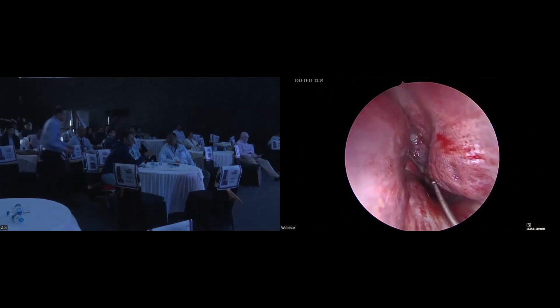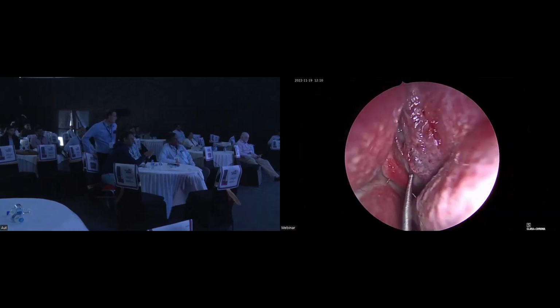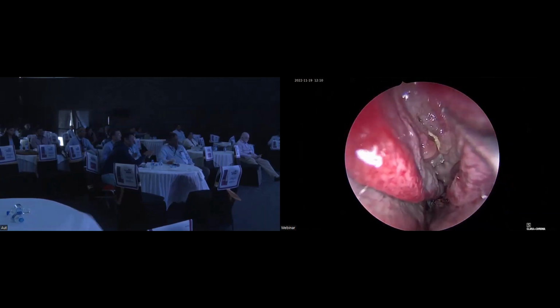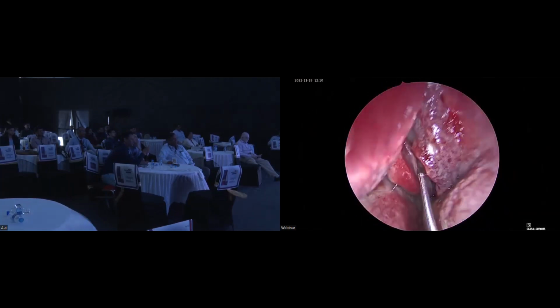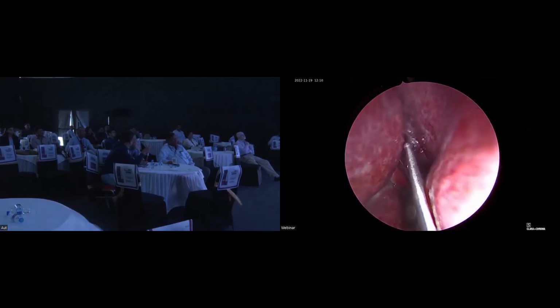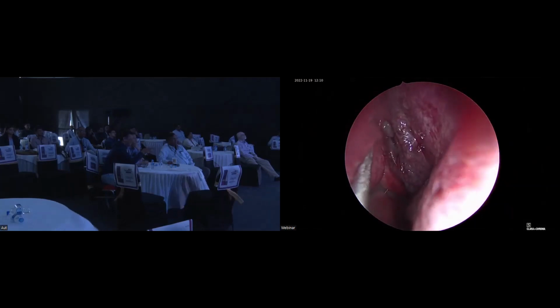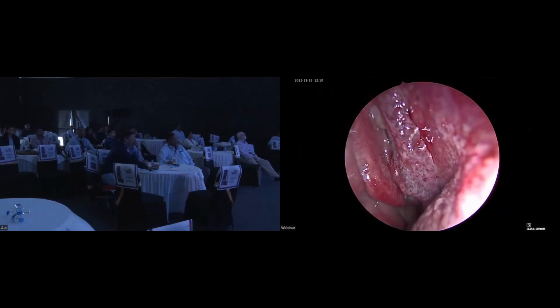However you give steroid, the patient will become fine, but it will not be resolved completely due to presence of this superficial fungal disease. You are seeing here the middle meatus. There is some deviated nasal septum and bulge, but I think I'll be able to manage with decongestion and all. I've got good space here.